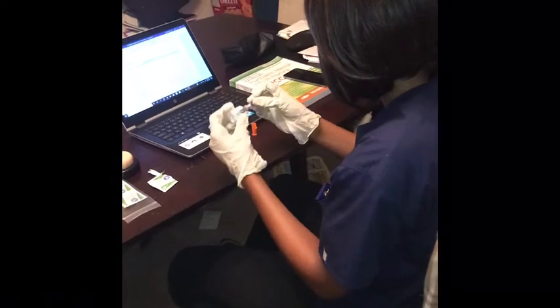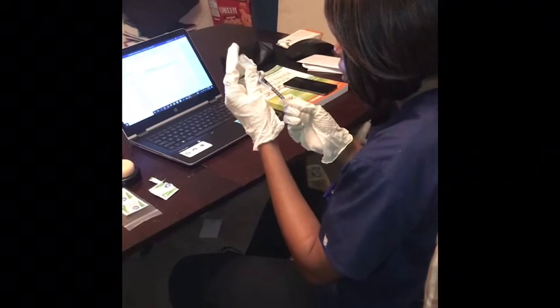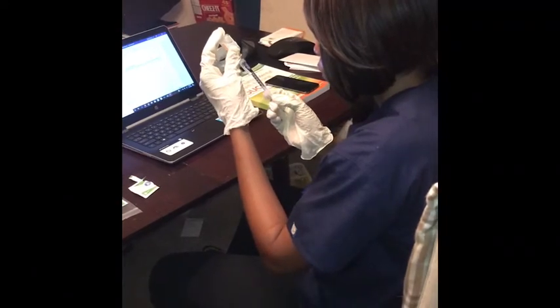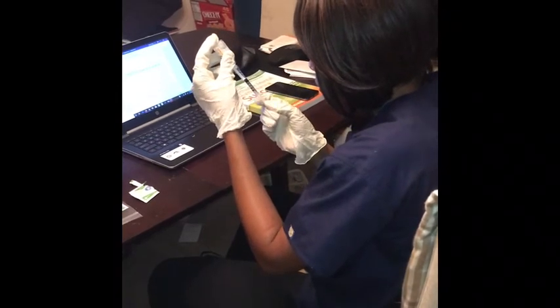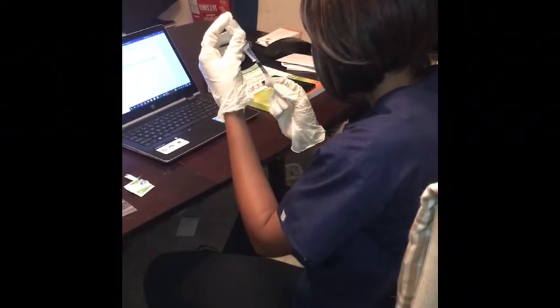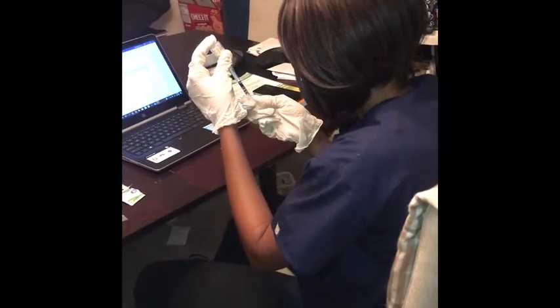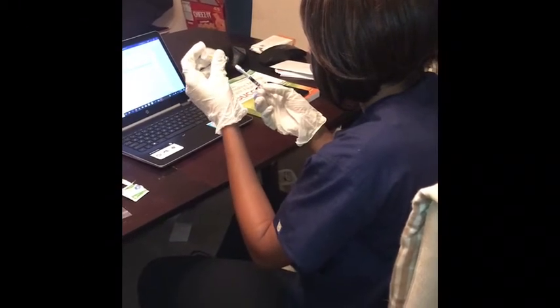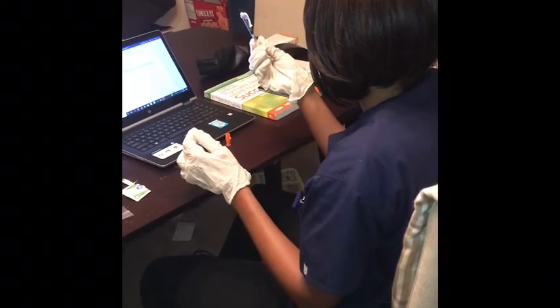And then I'm going to take out 58 units. If I get any bubbles into the syringe, I have to redo the procedure to get rid of the bubbles. Checking for the bubbles. There are no bubbles. And then I'm going to recap it.